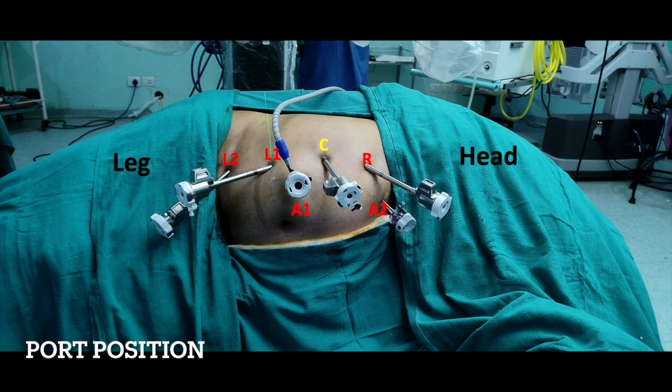Let's come to the port position. On the right hand of the screen, you can see the head end of the patient and on the left side is the leg end of the patient. From cranial to caudal, 4 ports are made in the same pararectal line. The extreme cranial port is the right working port followed by the camera port.